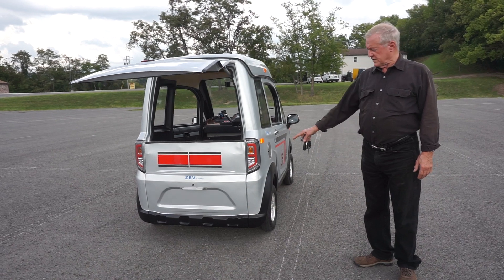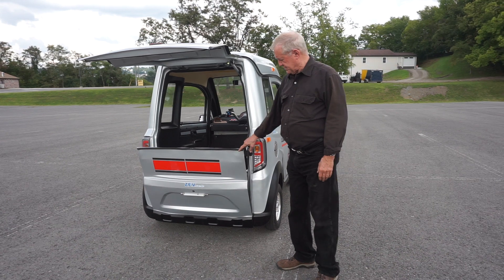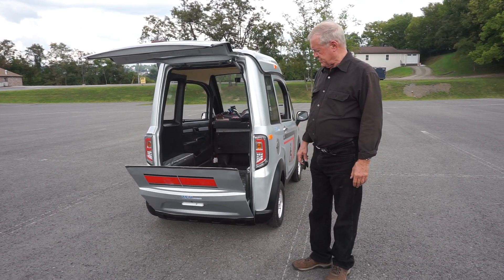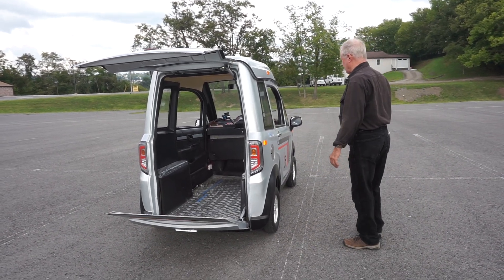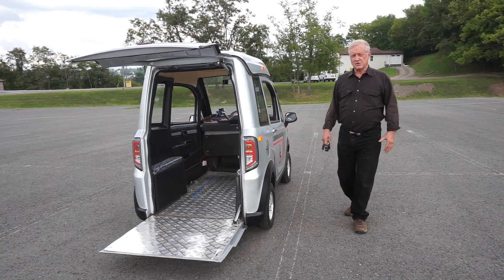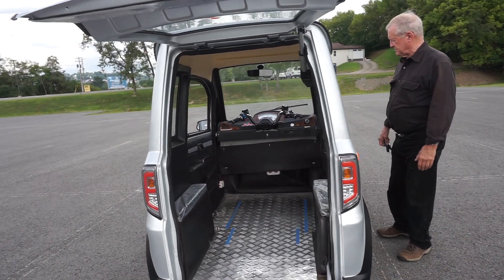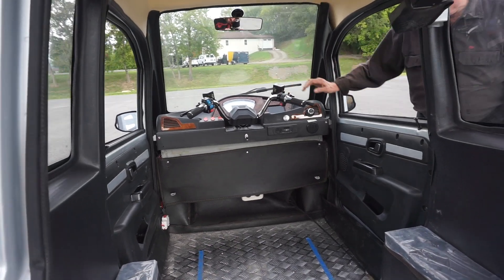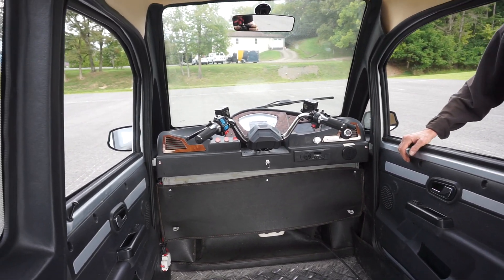This is not a liftgate, it's a ramp, so it'll lay down against the ground on this edge and then someone in a power chair can drive right in and park the vehicle. The vehicle has handlebars so that they can pull as close up to the front as possible.